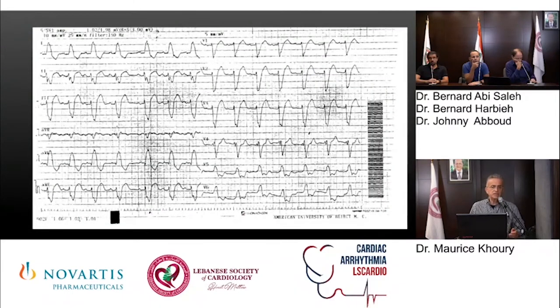So this patient was referred to you and came to your clinic, and you want to evaluate and see what can you give him better than this medication that his primary physician started. You see here on the slide the ECG, and as you see, it's a very wide left bundle. So this is a left bundle branch block with a first degree AV block.